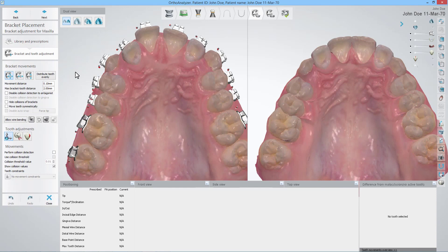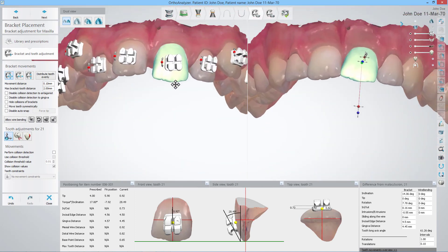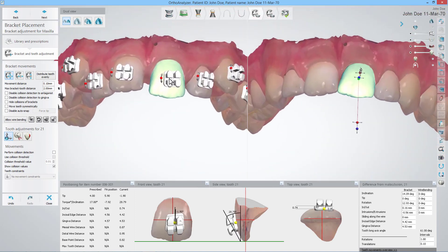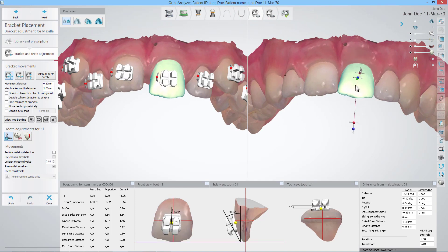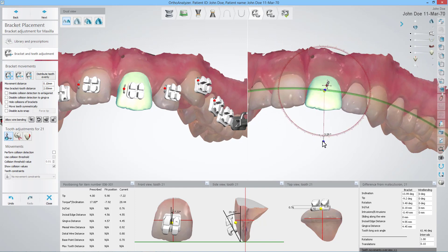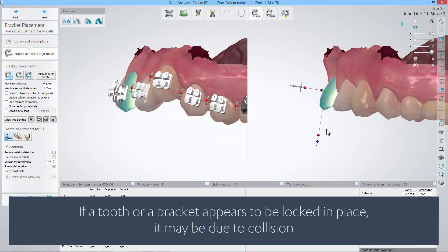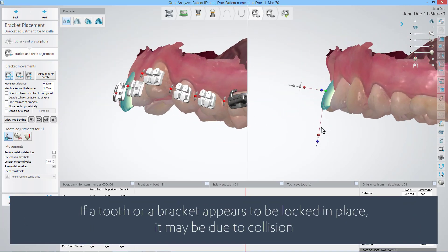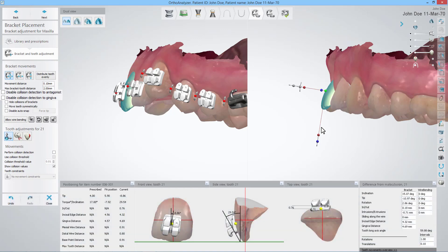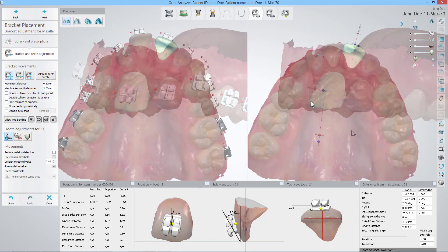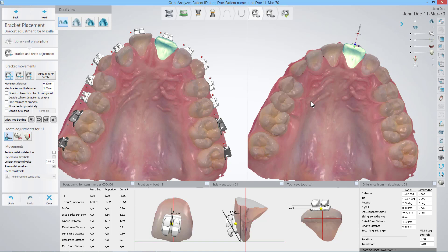The bracket adjustment step is the most crucial one in the workflow. This is where you perform the final adjustments of the bracket placement before validation. By default, everything will be placed according to your FA points, which you have set at the end of segmentation. The more accurately you have set and oriented them, the better the default placement will be. Select a tooth — you can adjust the bracket placement directly on the malocclusion view, or you can move the tooth on the treatment outcome visualization and the bracket placement will adjust correspondingly. Please remember, if a tooth or a bracket appears to be locked in place, it may be due to collision. It may happen that in order to move a molar bracket, first you will have to disable collision detection for the antagonist or gingiva.